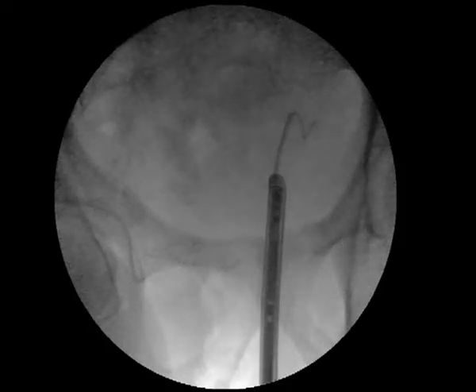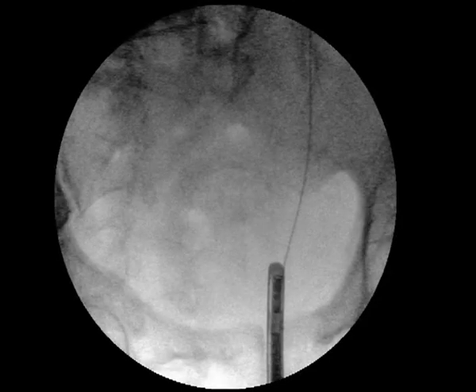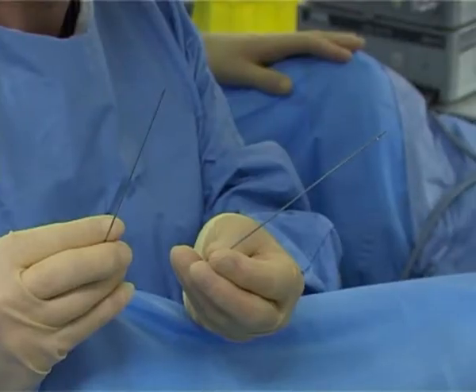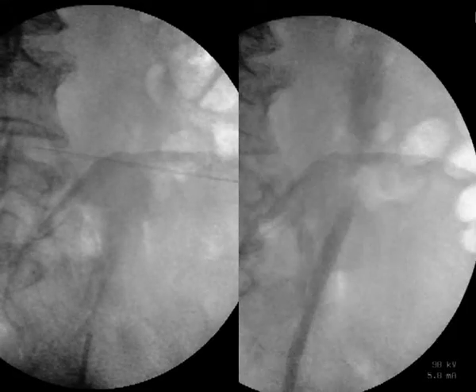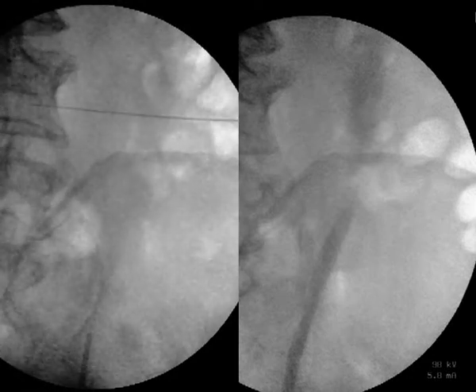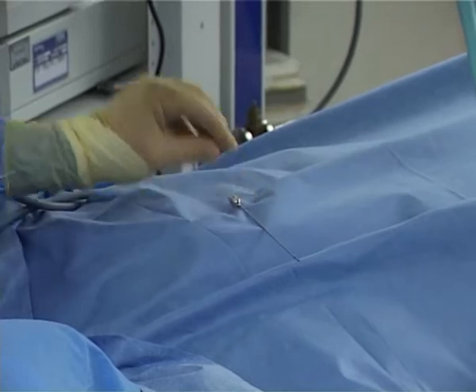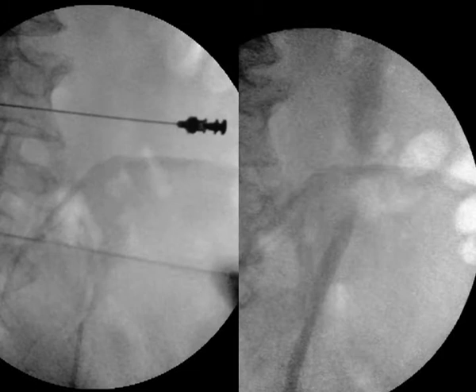A guide wire is passed through the stricture and left in place. Sometimes an initial glide wire must be replaced by a stiffer wire over a standard ureteric catheter. 2 metallic needles are used to mark the proximal and the distal ends of the stricture. Whilst the needles are placed and fixed, the ureterogram remains on the second monitor to provide the landmarks.